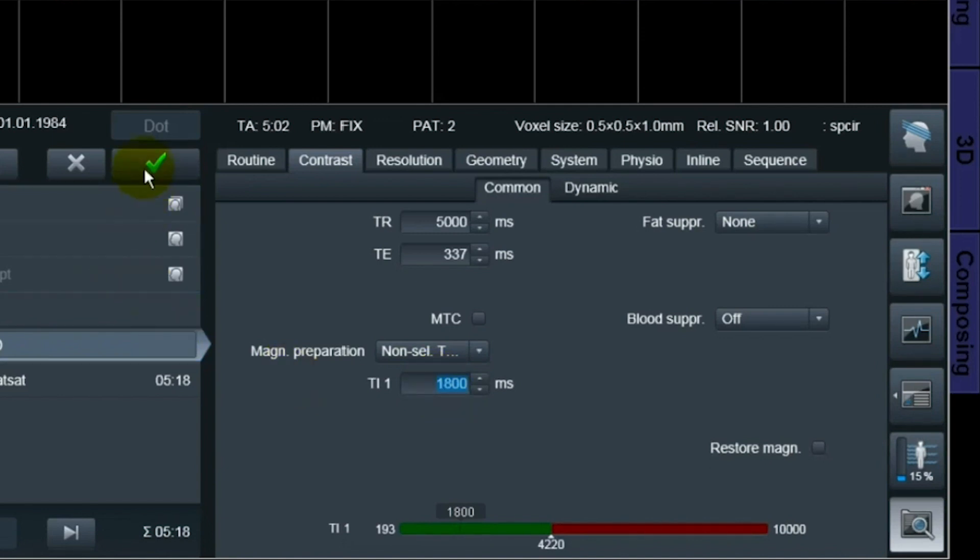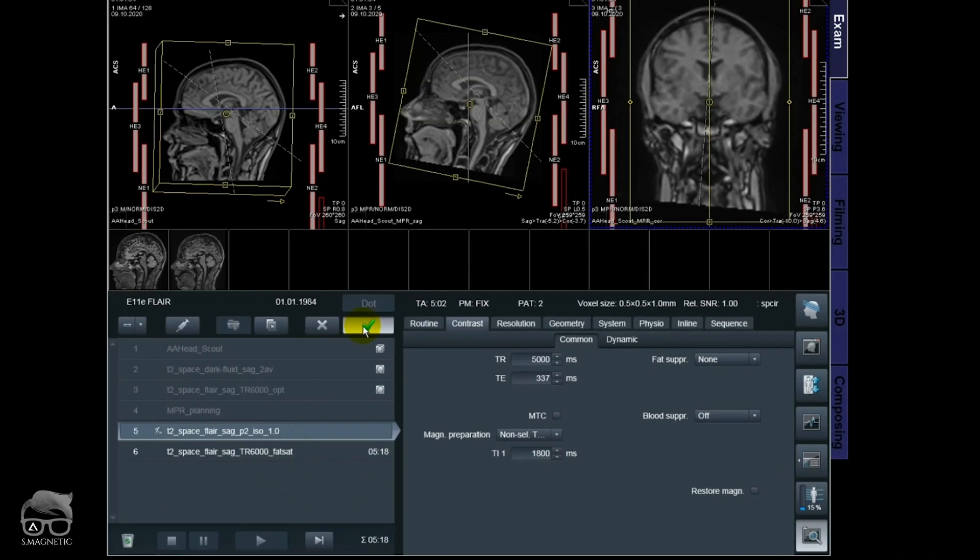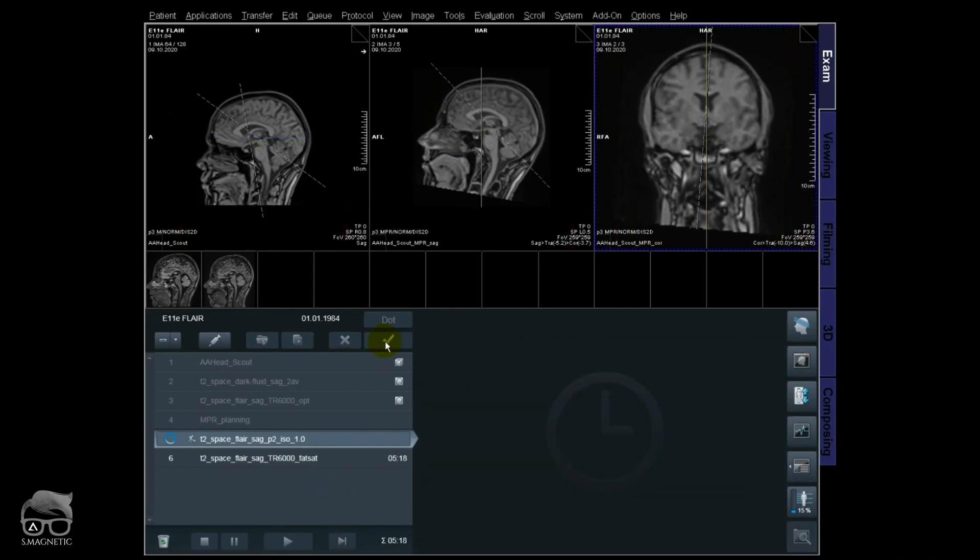Remember the TI time is adjusted accordingly to the TR time. If you're changing your TR, you should also adjust the TI time. So let's scan that one. I have the fourth sequence right there. Let's open that one.